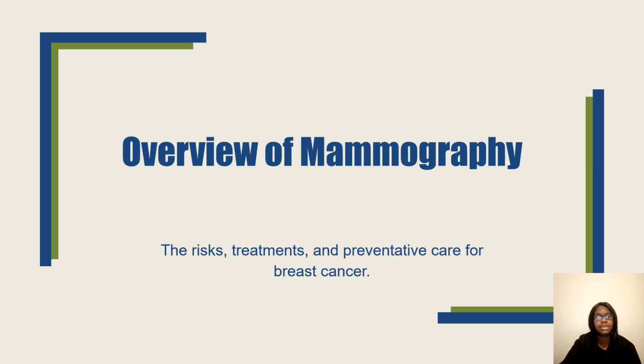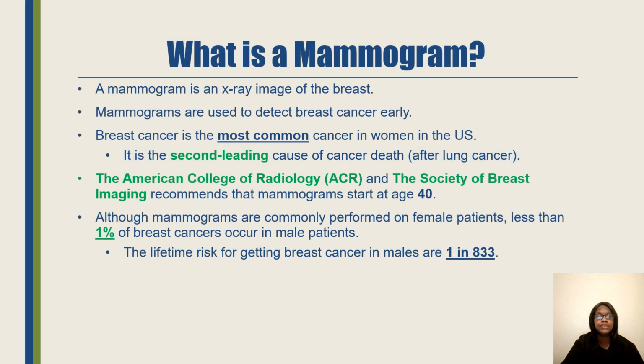So this part right here is just going to be an overview of the mammography department. We are going to discuss the risks, treatments, and preventative care for breast cancer. If you do not know, mammography is pretty much an x-ray of the breast. It is used to detect breast cancer very early, and it is the most common cancer in women.